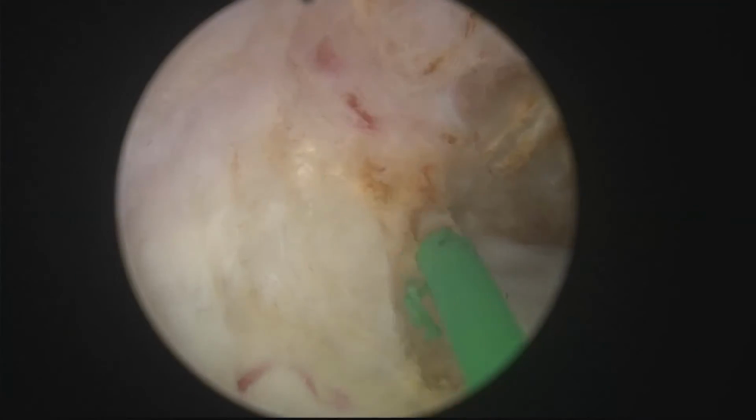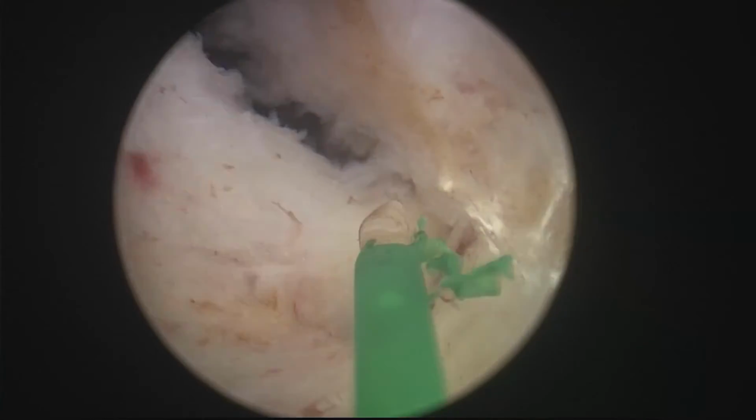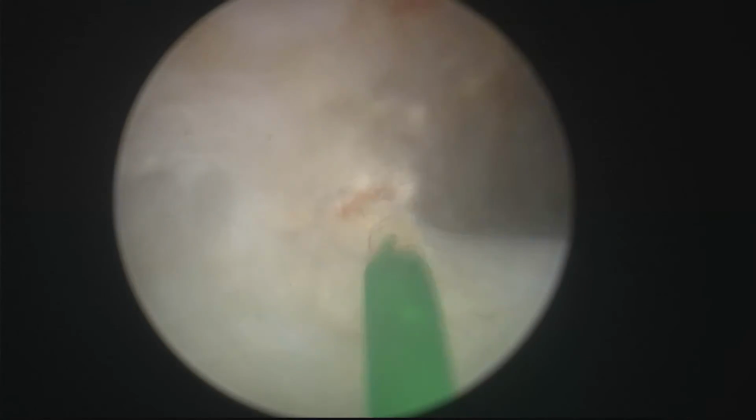Now the adenoma is tilted into the bladder, and there is the bladder neck that we have to cut. Very fibrous tissue, but nearing the completion of the enucleation of the residual tissue after TURP. So here you can see how the bladder neck is completed and the adenoma is pushed into the bladder.